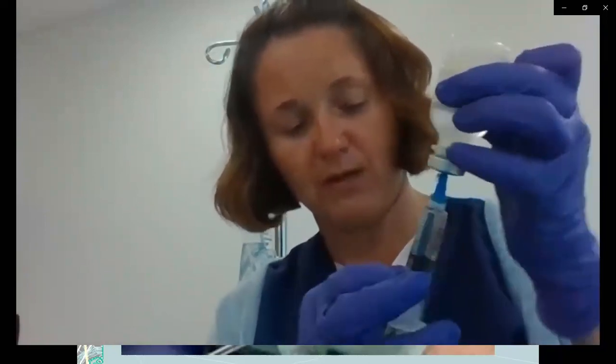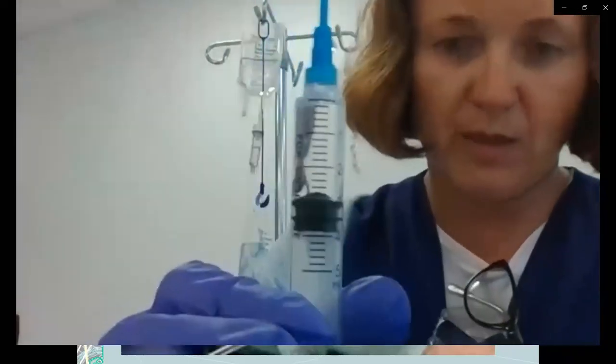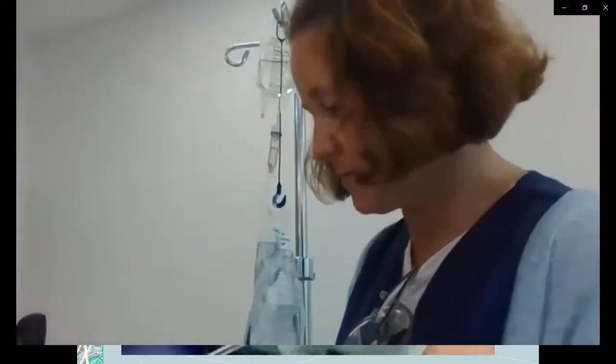Sometimes you're given the whole syringe. So I'm going to give 3 mLs. I've got a little bit of a bubble in here, so I'm going to try to get rid of that here. Sometimes if you just push it hard into the, there we go, that got it. Okay, so now I've got my 3 mLs. So I'm right at my 3 ml mark. Okay, this is not sharp, it's micro pen. Some micro pens are though. There's some of them that are needles, so then don't recap it if it's a sharp. This is the one.